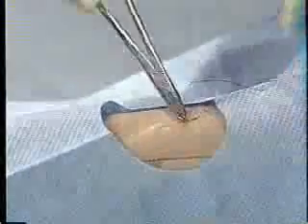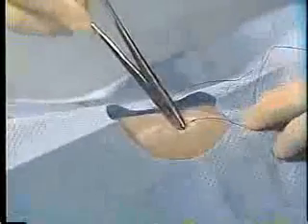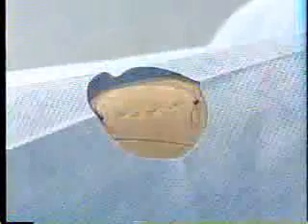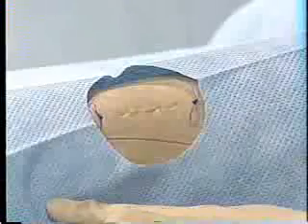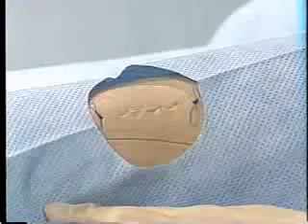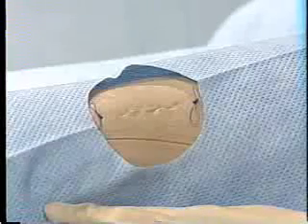and carry the stitch through the very tip of the wound, from inside the wound to some nearby site outside the wound. Cut the suture so that there is none protruding from the wound. This procedure can also be performed using monofilament, non-absorbable suture, but it must be anchored outside the wound and later removed by cutting the anchoring stitch and pulling on the opposite end.